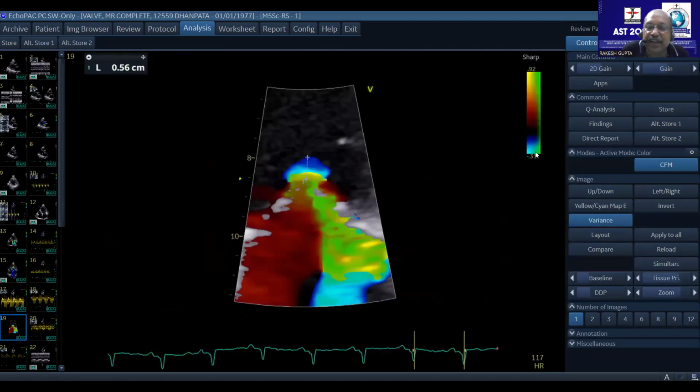Look, here's a 92, here's a 31. We moved our scale down in the direction of the jet. Correct? And then we look at these multiple hemisphere rings. So this is a radius of 0.56 from this peak to the leaflet tips.